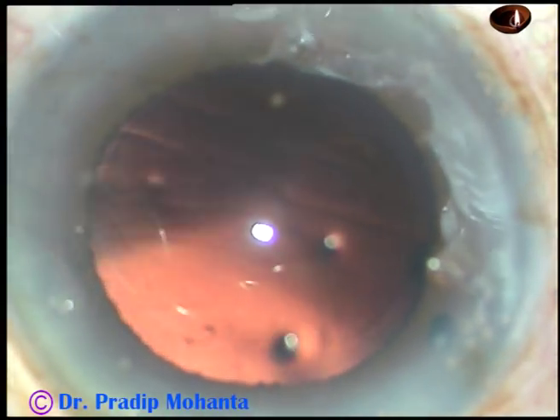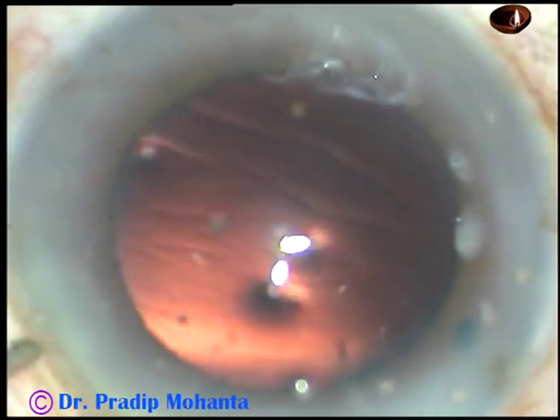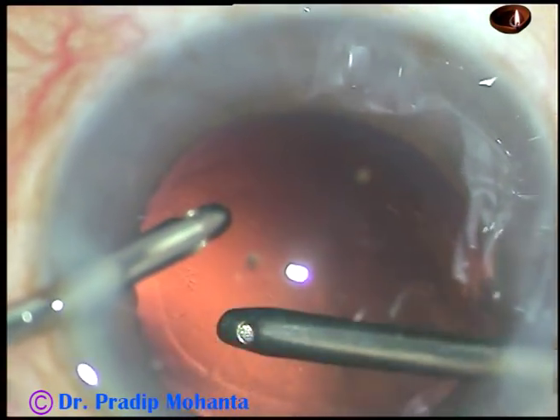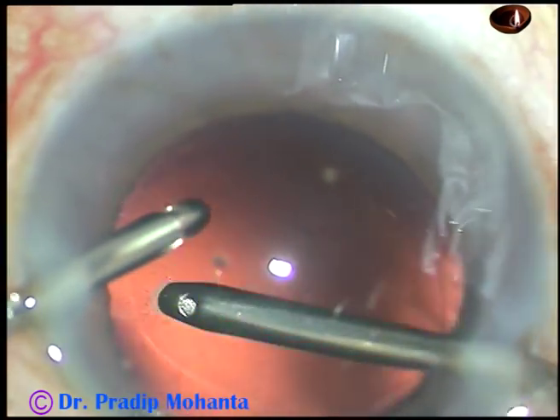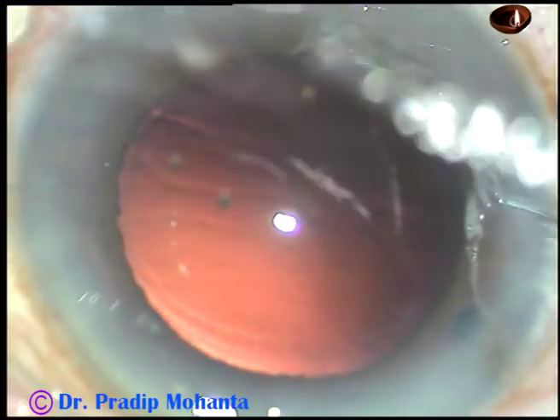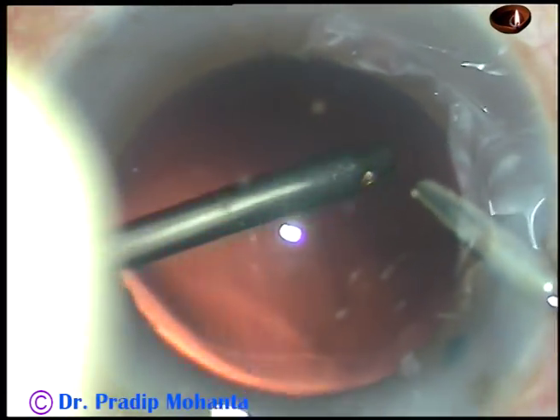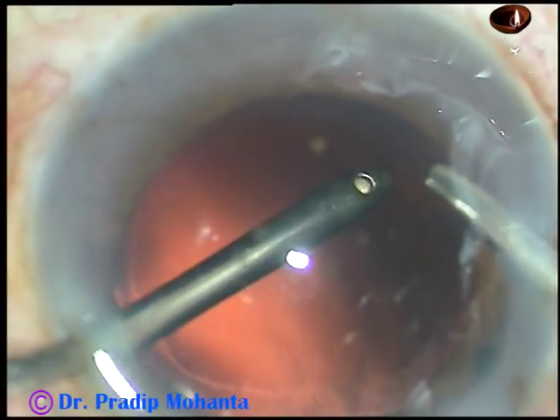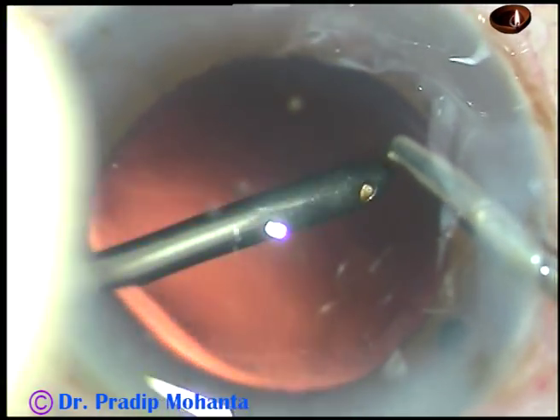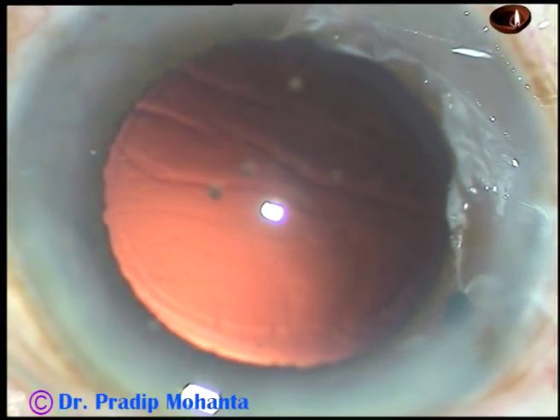And now, polishing of the posterior capsule is to be done. I have gone to IA2 mode — that is, capsular polishing mode — where the vacuum is very low. I am still in capsule polish mode, clearing the posterior capsule and removing the lens fibers. And it appears quite clean now.